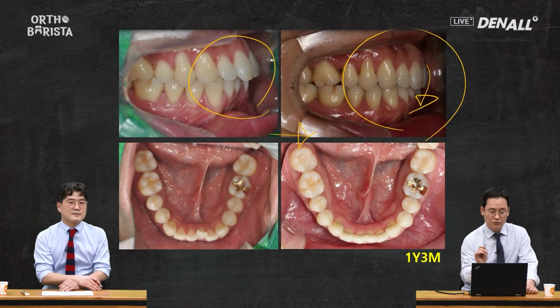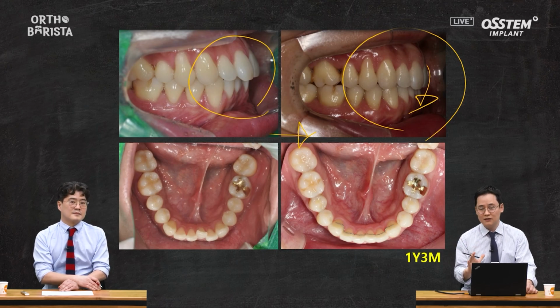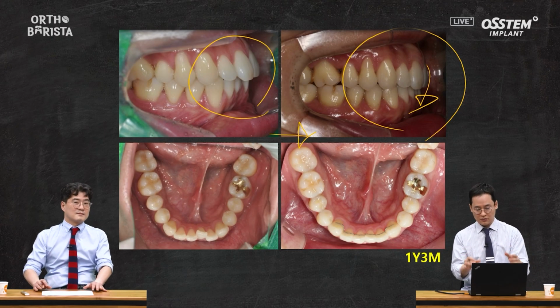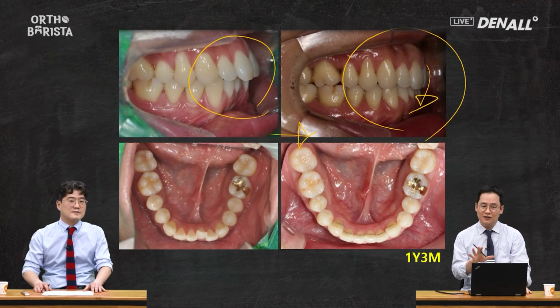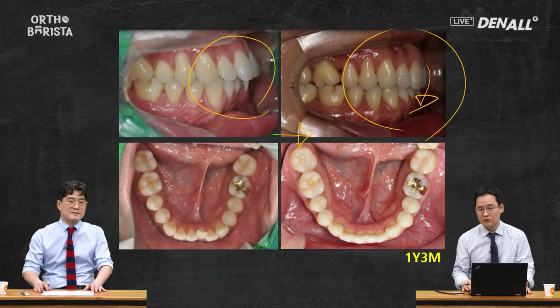This is why it's crucial to carefully monitor whether these movements are progressing as intended during clear aligner treatment. It's not enough to simply rely on patients wearing the aligners consistently and assume that everything is proceeding well because anterior-posterior movements seem fine. In many cases, these subtleties are difficult to detect chairside. Often, we only check if the aligners fit well and if the alignment appears satisfactory, which can lead to oversights. Therefore, taking photographs regularly is essential. Additionally, when addressing anterior-posterior movements, I'd like to emphasize that it's essential to monitor vertical changes.